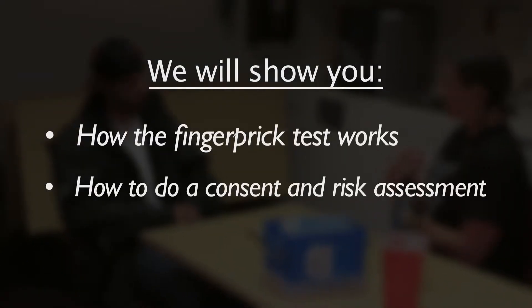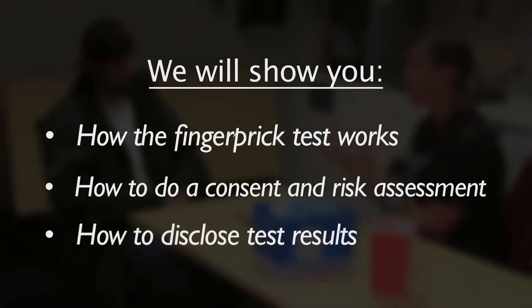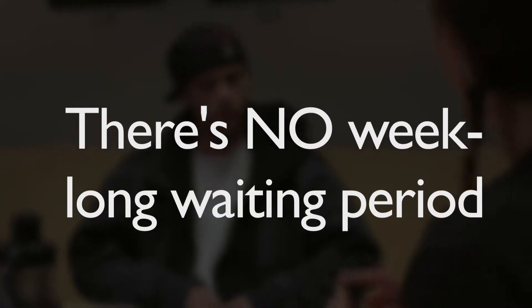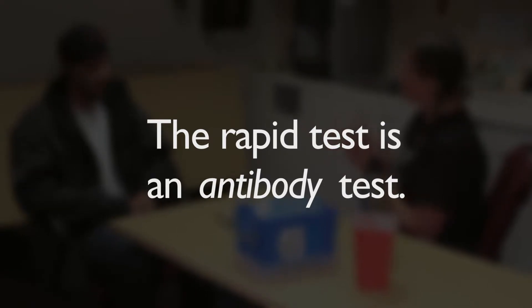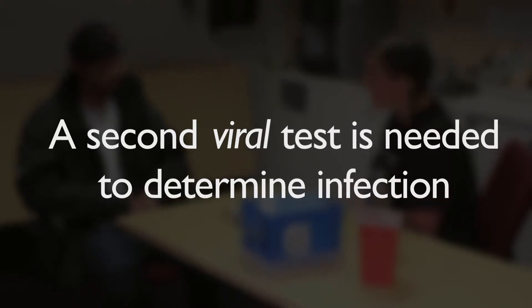We'll show you how the test works, how to do a consent and risk assessment with a participant, and how to disclose results. With the Rapid Hep C test, it takes only 20 minutes before a participant can be informed of his or her test results, so there's no week-long waiting period. Keep in mind that the Rapid test is an antibody test, which will only tell you if a person has been exposed to the Hep C virus. Your participant will need a second viral test to determine if they are currently infected with the Hep C virus.